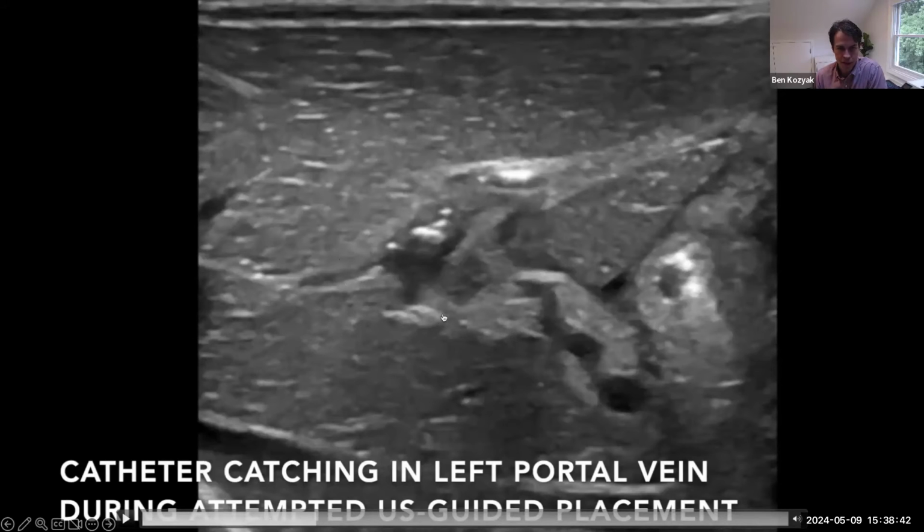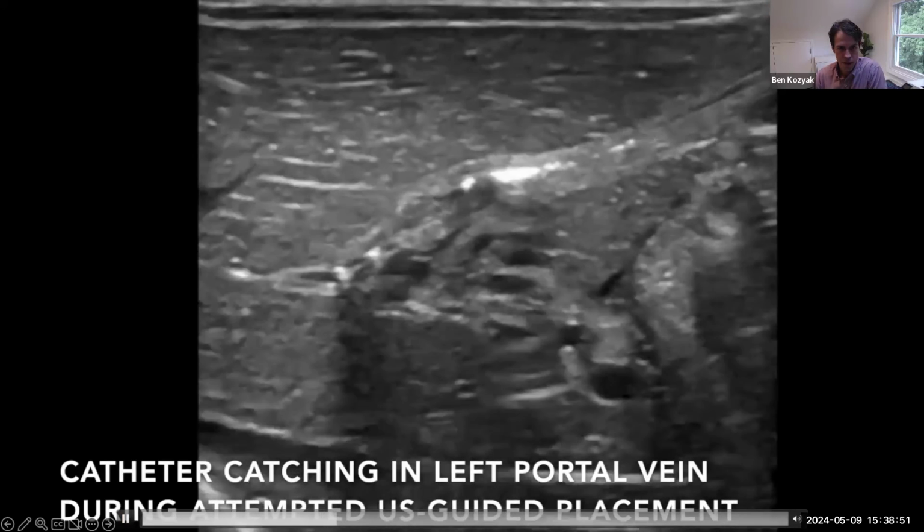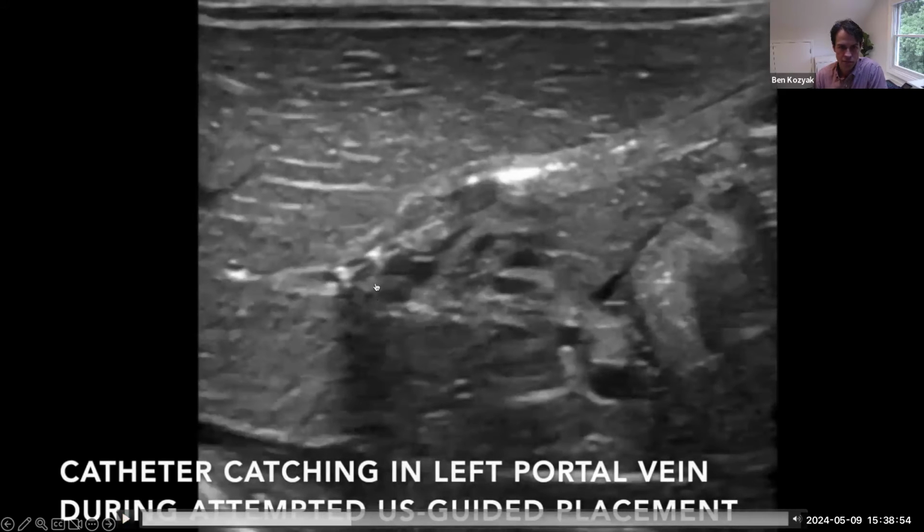And it's going to be really hard for it to go somewhere else unless you start using some pretty fancy tricks. So what we did was just left it there, and you'll see the second catheter, which in this case was a 3.5 French catheter, start to come in and blink up in here, and that catheter will navigate past this hazard and into the desired position in the ductus venosus.